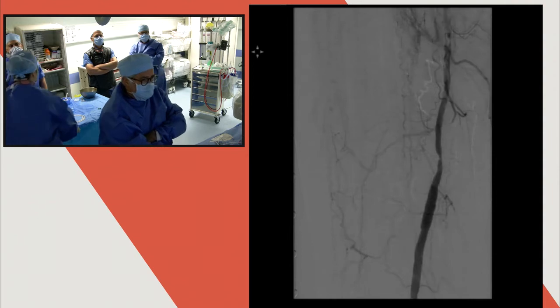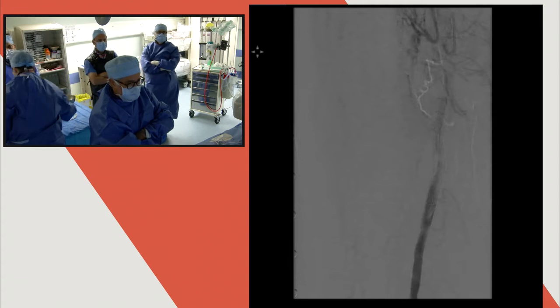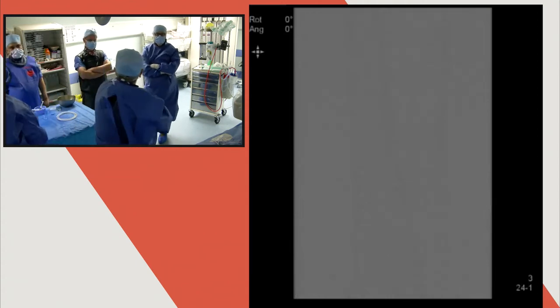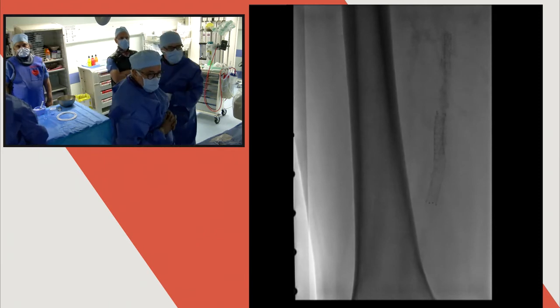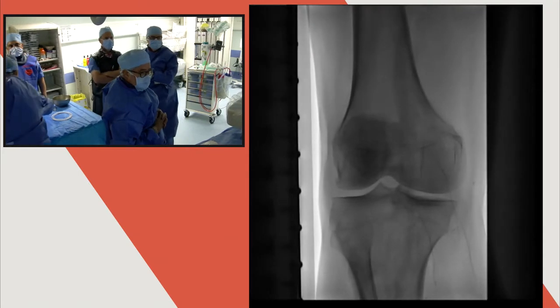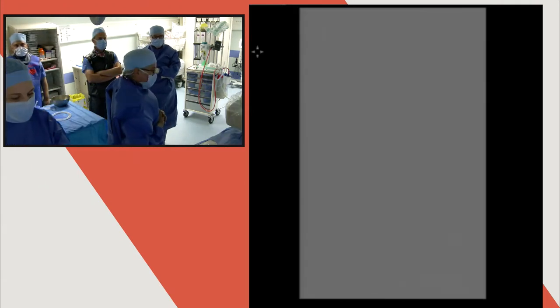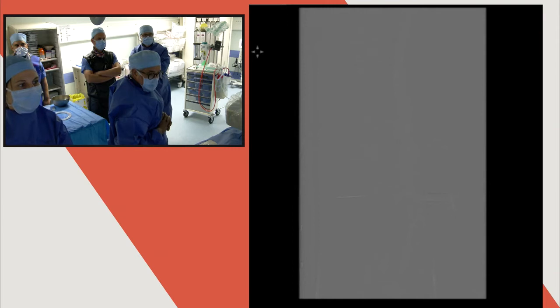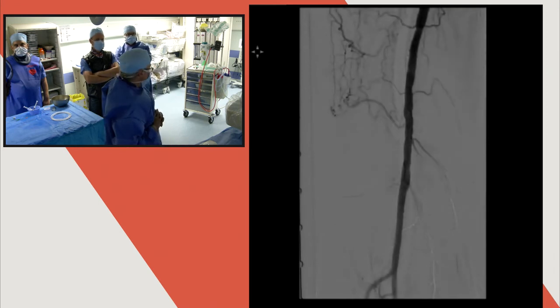With a global angiography, it was considered as occluded. So it shows the power of antegrade injection. Selective angio. Could we see the downflow? It is also a balloon expandable stent in the middle. But he has a history of a very old one. It looks good. It confirms what we said before, that balloon expandable stents work in the SFA, and they are short. It's okay. Perfect.